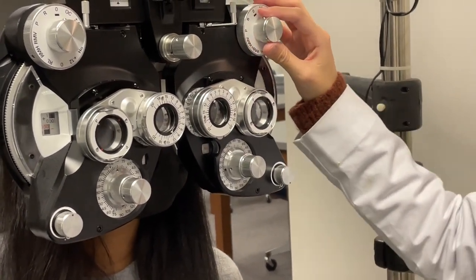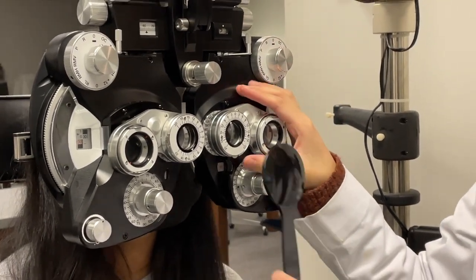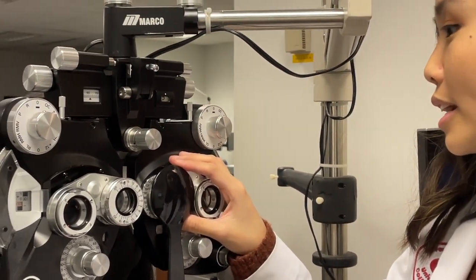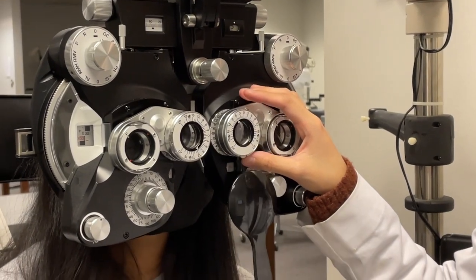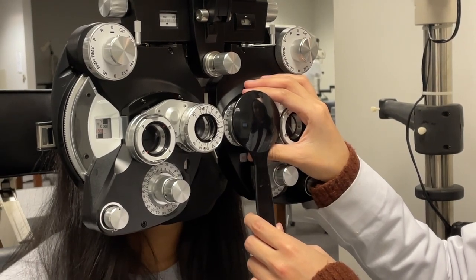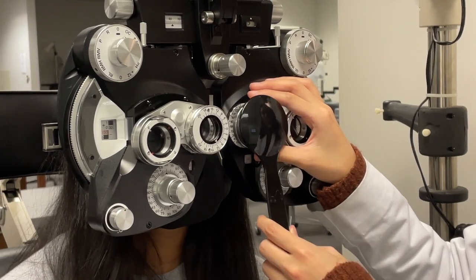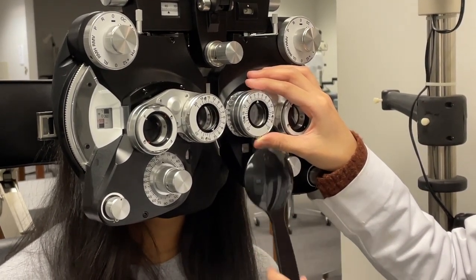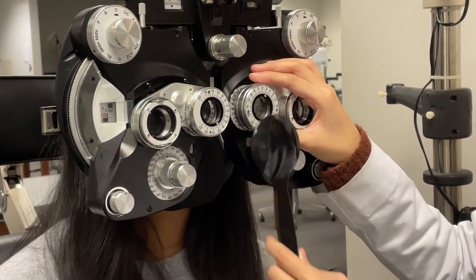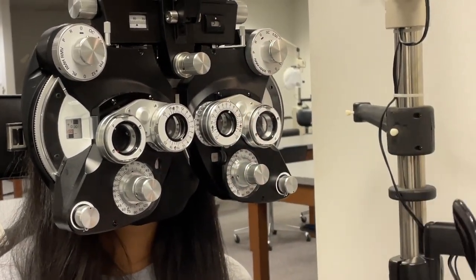All right, Mrs. Lee, when I unocclude you, you should see two charts, one on the top right and one on the bottom left, is that correct? Yes. Okay, so our goal here is to make them line up right on top of each other like buttons on a shirt. I'm going to slowly move the one on the bottom and you just let me know where it is compared to the top, whether it's to the left, to the right, or directly under. Okay. Left, left, left, left, left, left, right under. Okay. Patient is going to be 4 prism diopter ESO.